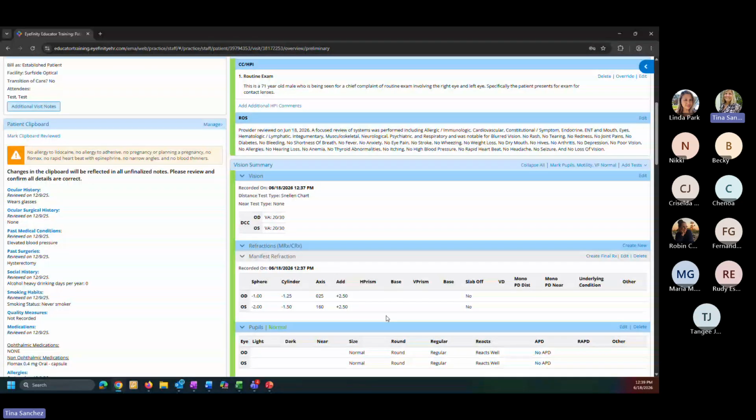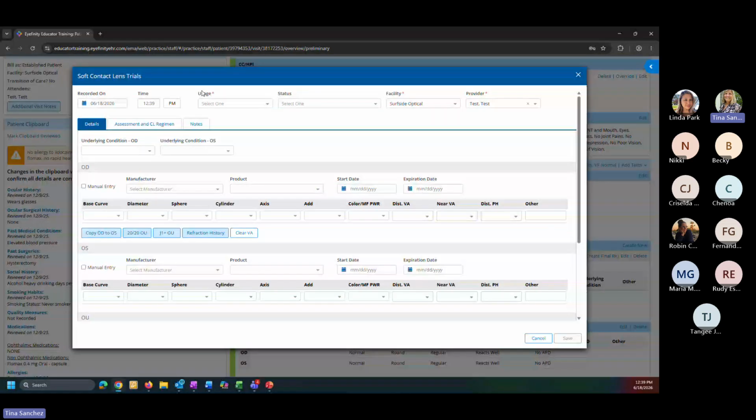So we always have to have a usage up here for your contact lenses. If I'm multifocal, it's up to you if you want to use it here. I like the statuses, especially if the doctor gives the patient a trial, has them put it in, and it doesn't work for them. I like that you can put dispense unsuccessful here, because then if the doctor goes back later next year and is looking at giving them a different trial, he can go back to the list and say, oh yeah, this trial did not work for them.